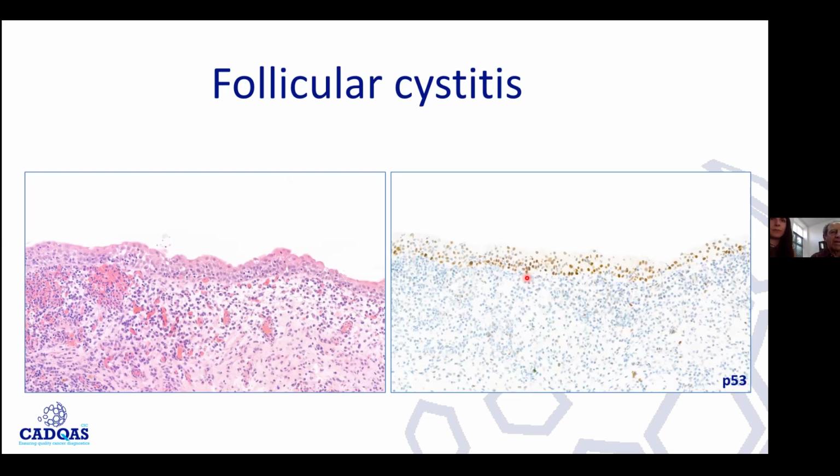For sure. There is one last question. I know we are a bit over the hour. On surgical specimens, when a tumor shows zones of intense P53 staining and zones of weak or moderate staining, do we attribute this to poor fixation or to subclonal overexpression? And that I do not know, because obviously with poor preservation of tissue in large specimens, I would interpret it in context like we do sometimes with MMR or other immunohistochemical markers. If it looks like it's from very good fixation, then fine.